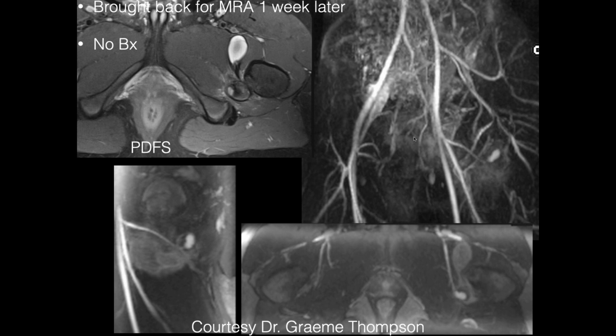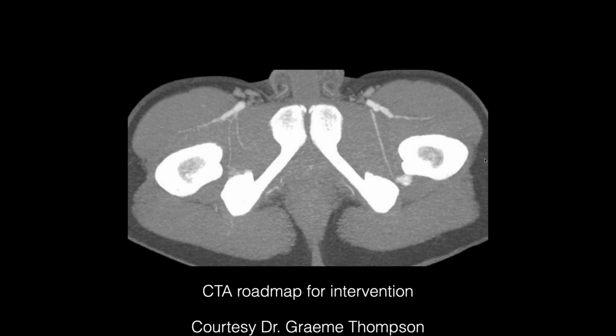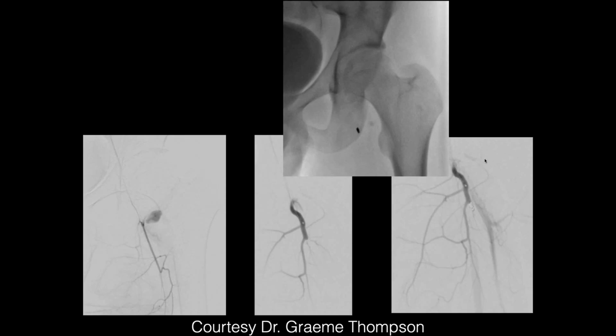What do you think, Andrew? I think, is this the circumflex going around? Is there an aneurysm there on the left side? Well, yes. I was looking at the bottom picture. I thought there was a saccular aneurysm extending there. Here? Yeah. It looks like it's leaking. Yeah, you can see the aneurysm.